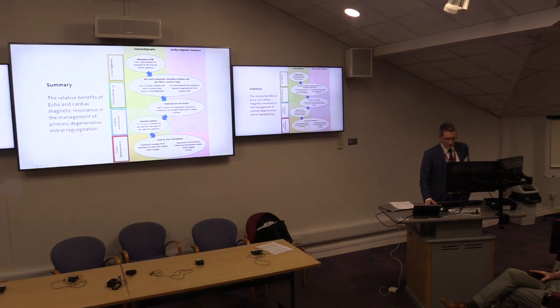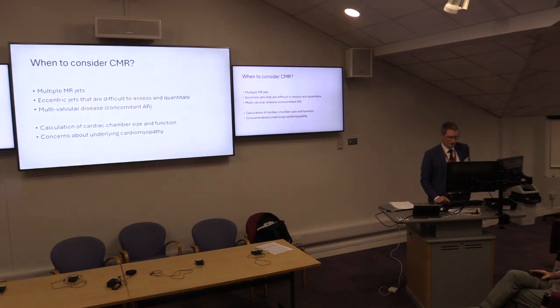And I think there's still a lot of work to be done in terms of automated quantification. So in the last 5 years, we've gone from doing 2D measurements routinely to 3D measurements, and I think that's going to be the way forward, but I'm hoping it's going to be easier and more automated with time.